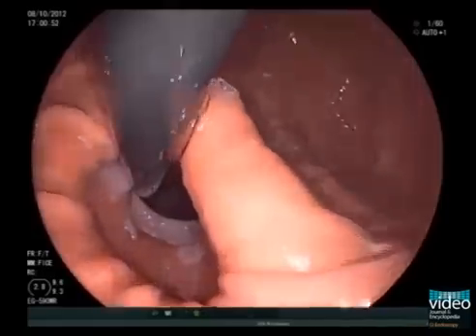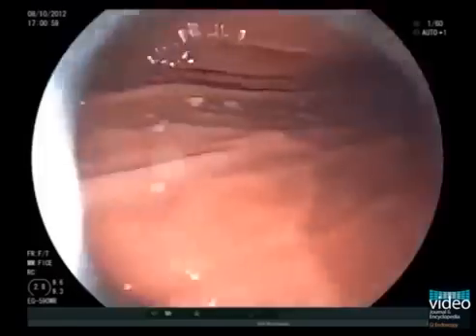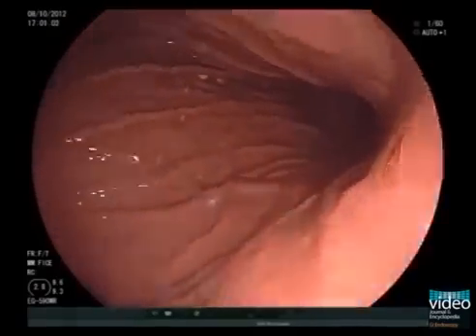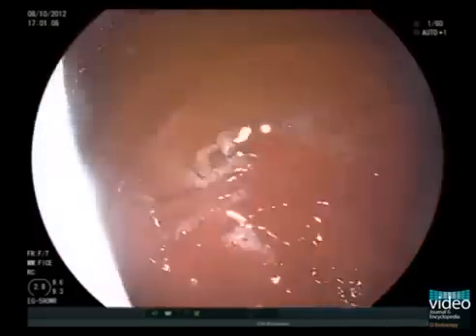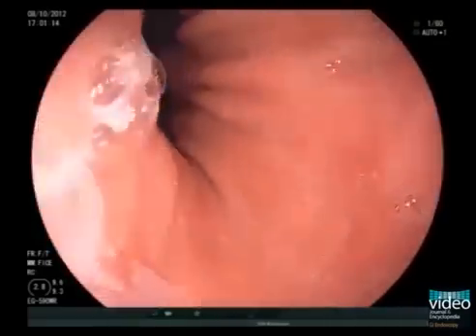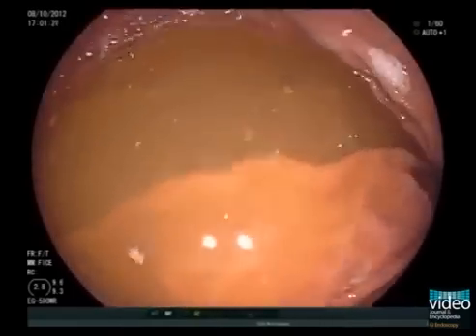After examination of the cardia and fundus in retroflexion, return the endoscope tip to the original position in the upper body. Withdraw the endoscope with arc-like movements to examine the upper body and cardia. At the end of the procedure, before you withdraw the instrument from the stomach, always make sure to aspirate as much air and gastric components as possible to deflate the patient's abdomen.